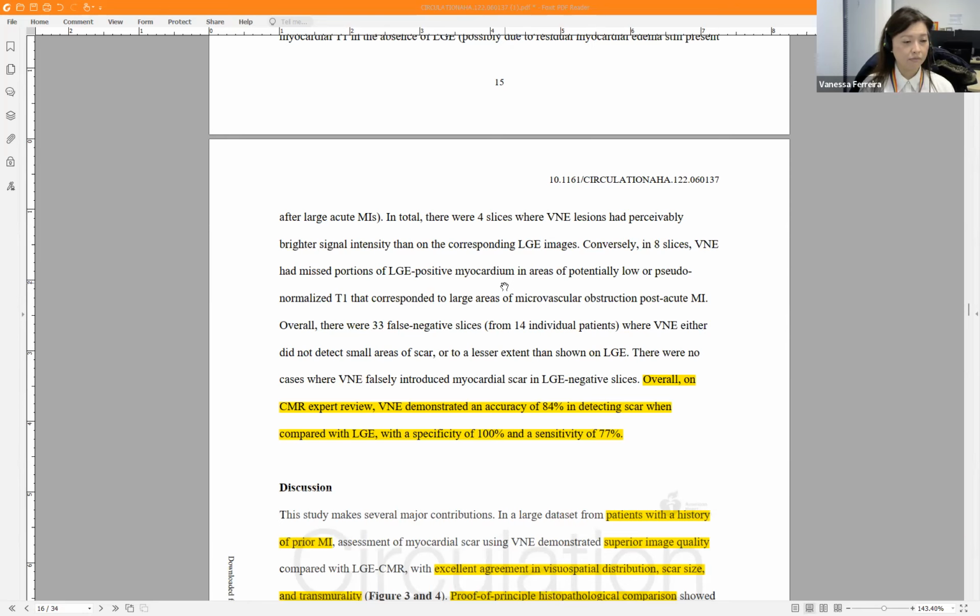Also a good point. Okay, last question from Javad. Is this algorithm feasible for every scanner, or should it be trained for each scanner? Currently it's trained on a data set acquired from a Siemens scanner, so it works with a single vendor. But because the deep learning algorithm is data driven, we can add new training data sets from different scanner vendors. And if we train with a sufficient data set from different vendors, I believe the model can work with data sets from multiple vendors. Yeah. Okay. Thank you. We had already addressed the very last question.